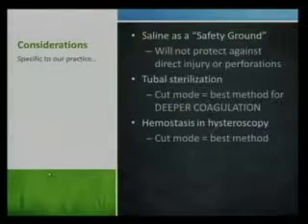This is when you're using the robot or anything and you have a bipolar and you get into bleeding. That's why, when we're using the robot and you cut the pedicle too soon, it starts bleeding all over the place. You can never get it to stop. And this is the same thing, because the blood is dispersing all the charge. So it's a kind of neat principle to think about.